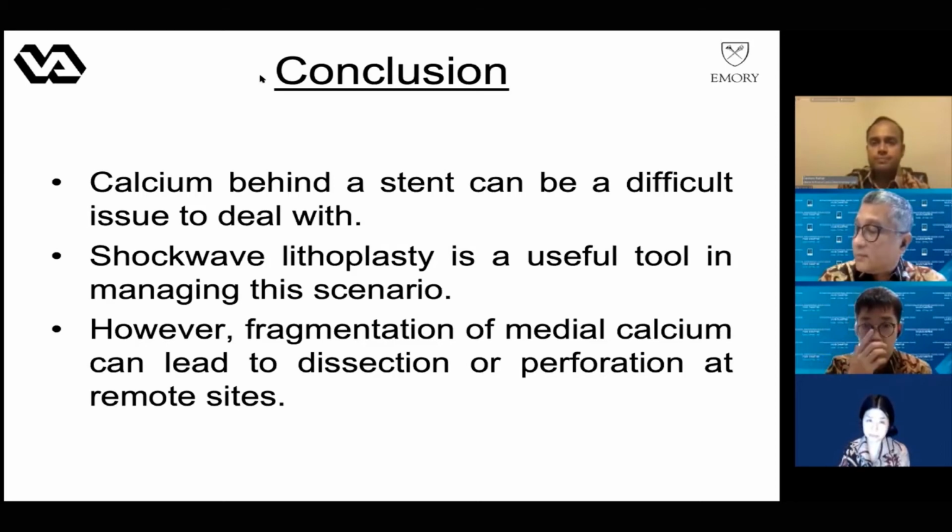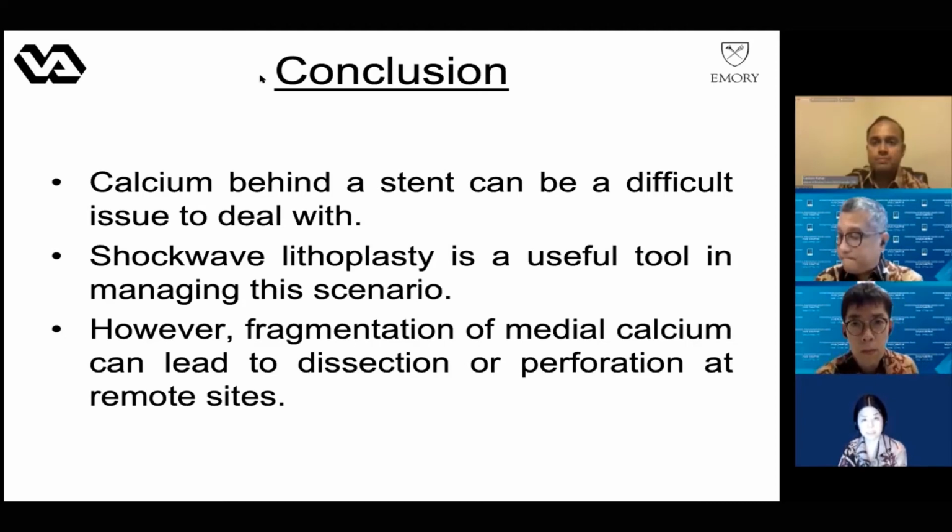Some of them, the operator decided to do the excimer laser with contrast, and some of them did not. Clearly the patients who had such laser had a good fracture behind the stent, and they got good stent expansion. But I do think this is a last resort if you really need it. But we know that works sometimes. Yeah. Thank you very much.